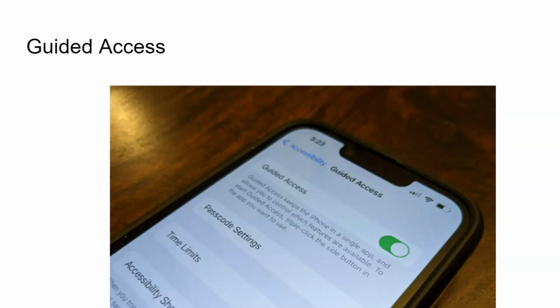Some students may have two iPads, one to take a break or do work on, and the other one to communicate. Think about it like this. While I'm watching a video or playing a game on my computer, I might want to talk to my friend about the game or video. The same concept is here if it's a communication device and an extra iPad.